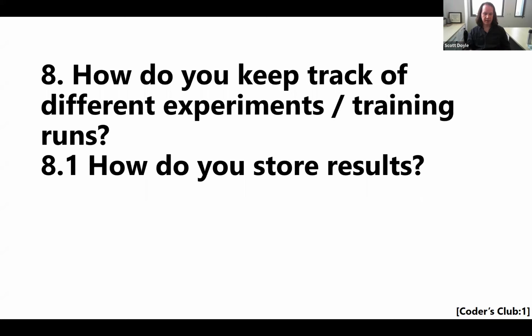What I think is less easy is when you have like, okay, we did this, we tried 3 different models, we didn't get good performance. Now we're going to go back, we're going to change the set of classes that we're looking at and change the magnification of the slides that we're looking at and the patch size. So the model changes, the data changes, like everything changes. So if you're in that phase of your project, then these tools I think are harder to use, unless I'm wrong.